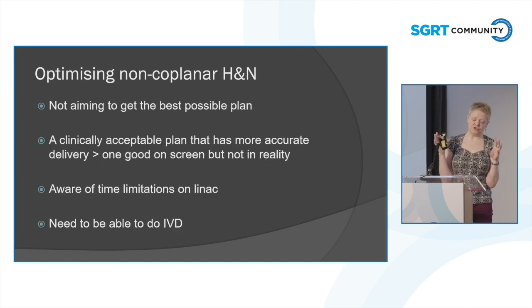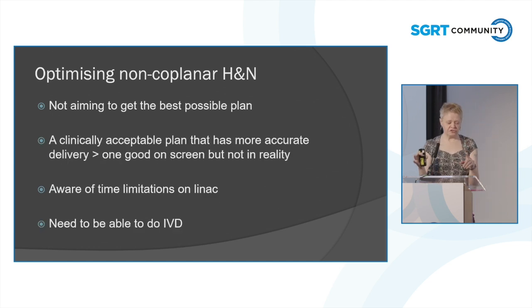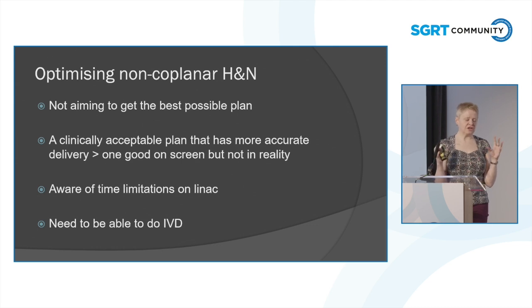It's important to state that with this study, we're not aiming to get the best possible plan, we're aiming to get the best possible plan in the time constraints that we have, but that is clinically better when it is delivered. So even if the plan is suboptimal to a coplanar plan, if it's more accurate on delivery so the patient receives the treatment that the doctor is seeing on screen, then that is better moving forward.